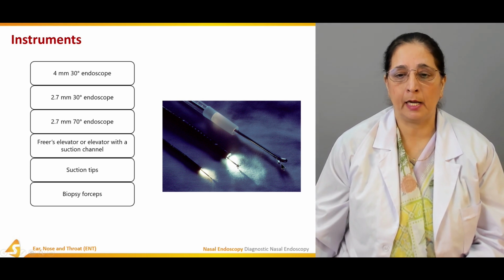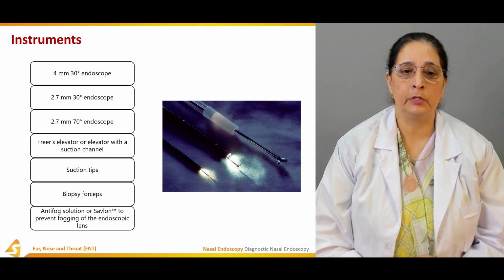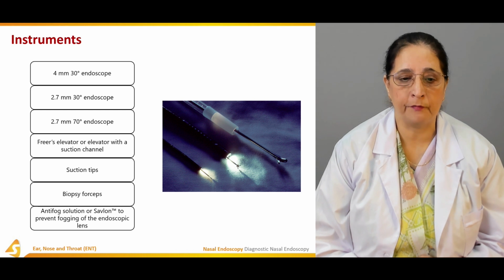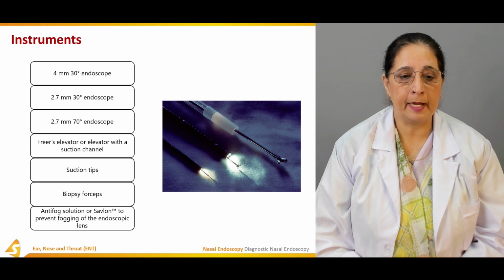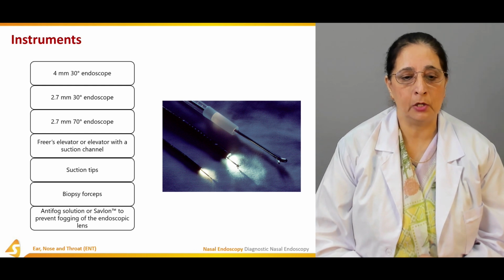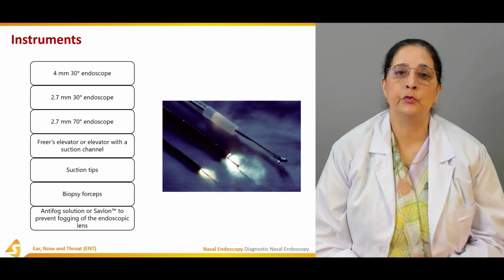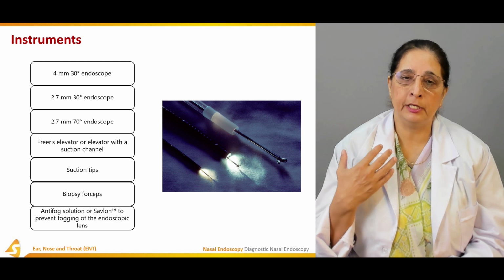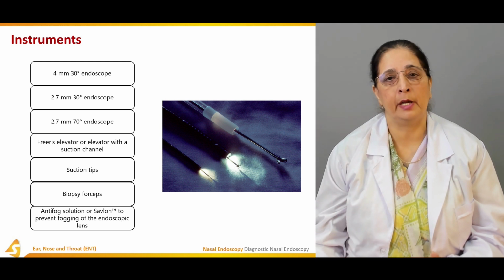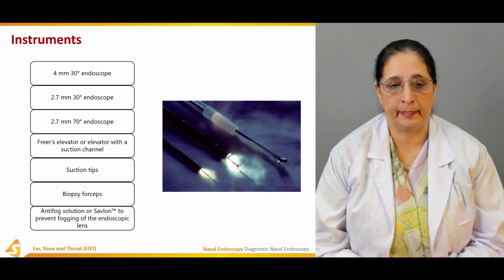We also use anti-fog solution or Savlon to prevent fogging of the endoscopic lens. So these are the different instruments. We have different endoscopes, with indications for which one to use, and different sizes are available.